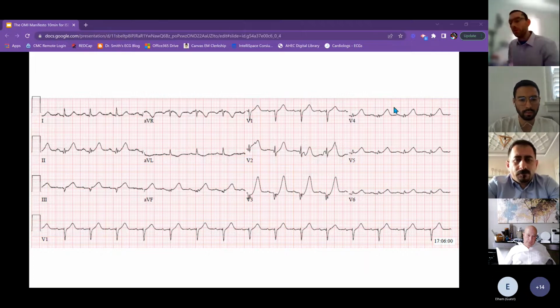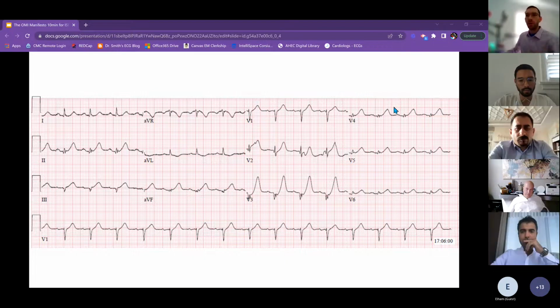Here's a patient who came to me in my emergency department complaining of acute left shoulder pain after lifting a heavy box. Here's his EKG, and there's not any real significant ST elevations or depressions. Maybe there's the tiniest hint of elevation in 3, but there's no STEMI criteria and no significant elevation here. So what he does have is hyperacute T waves in a very, very large distribution. I was concerned for acute LAD occlusion.